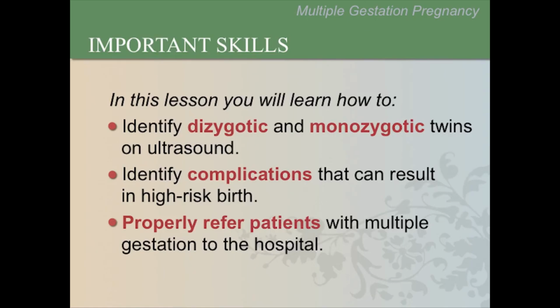There are three main skills you will learn in this lesson. You will learn how to identify dizygotic and monozygotic twins on ultrasound, identify complications that can result in high-risk birth, and to properly refer patients with multiple gestation to the hospital.